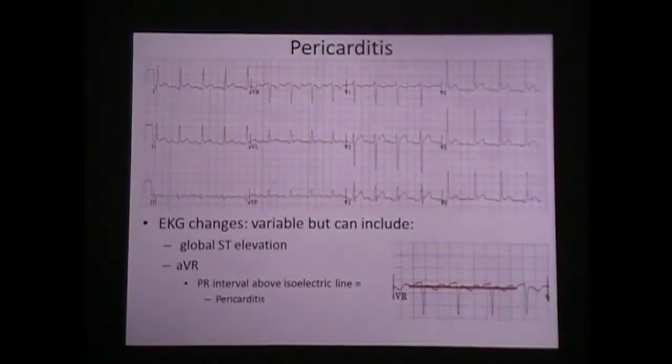So I was like, oh wow, I found a use for that. Because it doesn't have anything in the injury patterns for ACS. But if you've got an elevated PR segment, and they feel their heart beating, it's better when they lean forward, all those kind of things, and you got that, you're like, hey, I'm smart, I got pericarditis possibly.